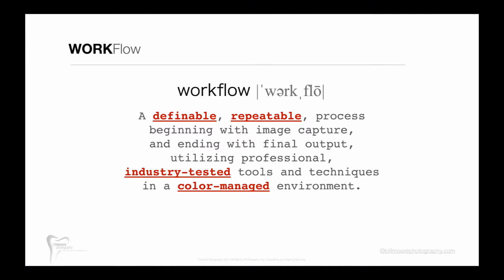And the process begins with image capture and ends with the final output, whether that's emailing images to your lab or another doctor, or sharing images with a patient during a consultation.